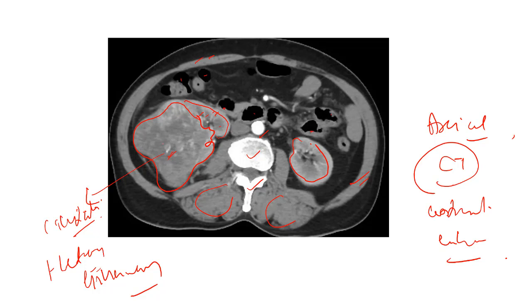What can it be? Till now what we have understood, okay, calcification and ossification is more favoring towards RCC. So if our lesion looks like that, which has some ossification, calcification, our diagnosis will favor more towards RCC. But in our case, was it an RCC? Were you able to see any calcification or any ossification? Was the mass a little irregular? No. So here our mass is probably not an RCC. Till now we know that it can be an angiomyolipoma, but it's not an RCC. Although our radiological diagnoses are always not confirmatory, we have to have a histopathological diagnosis. But how we can go towards a certain diagnosis, I'm trying to tell you like that. Okay.